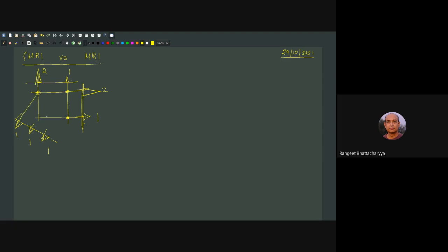These intersections must come from all of the spectra. Now you have how many intersections here? One, two, three, four. You have four intersections, and you have to do some calculation to find out which intersections are important. For example, this 2 means that two intersections are counted, each one giving you signal. So one, two, both giving you something. So this is a possibility.